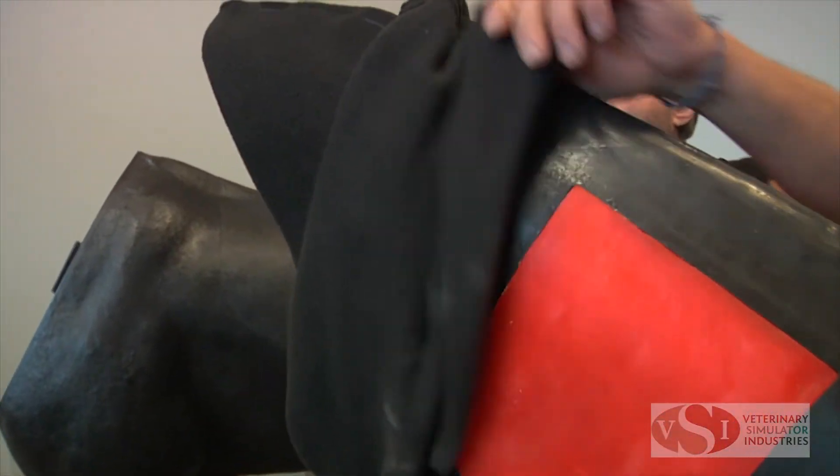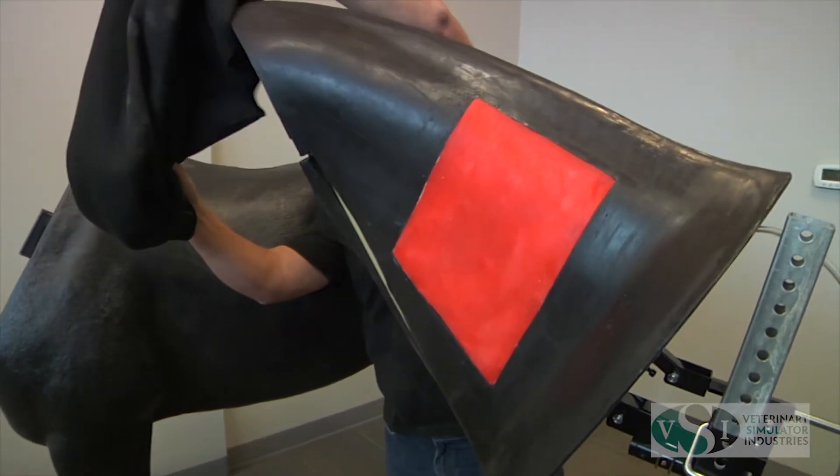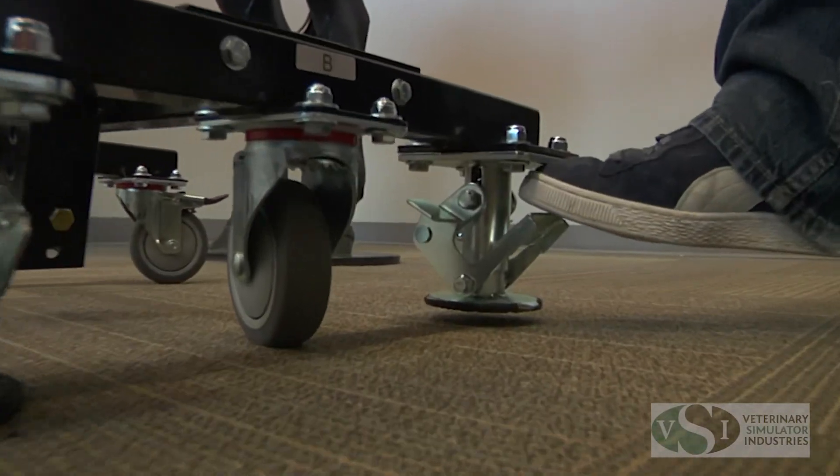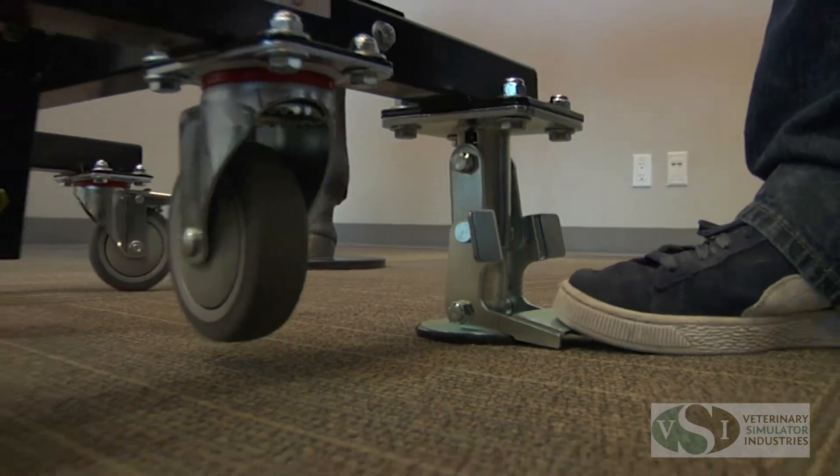The fleece neck cover is replaceable, as are the IM pads and venipuncture tubing. Prior to using the model, ensure the casters on the stand are in the locked position, as demonstrated.